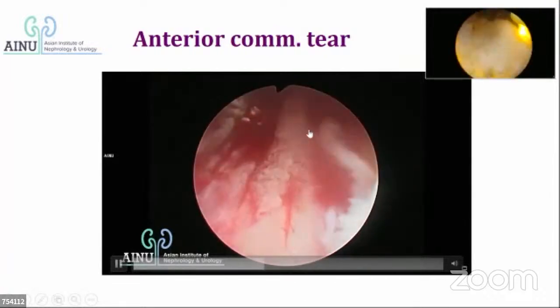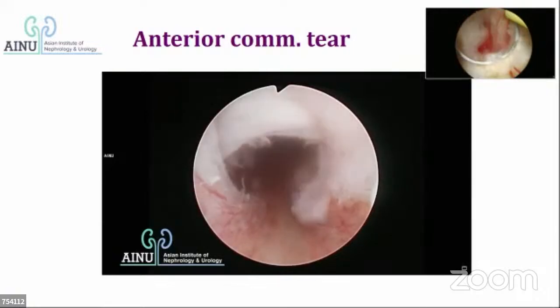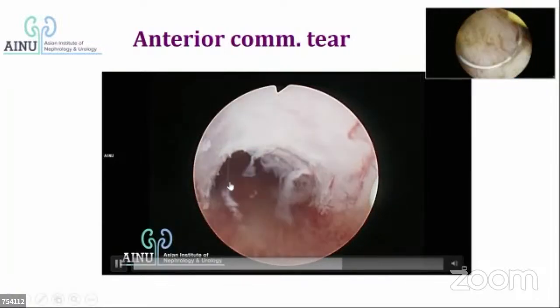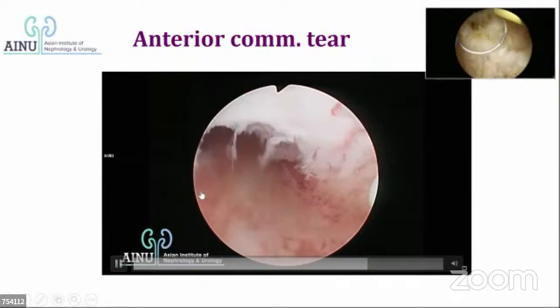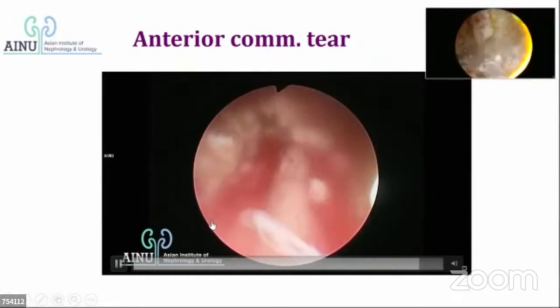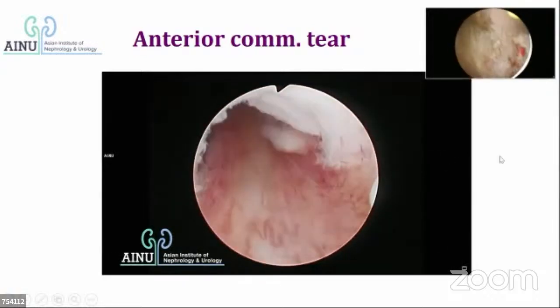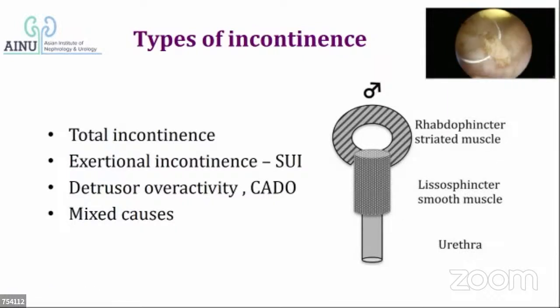Most of these things do produce a transient incontinence, but they do heal and produce continence. This patient might have incontinence because the resection has happened much beyond the veru, right up to the pelvic diaphragmatic area. So when you have this sort of an injury, incontinence may be quite certain, or if it doesn't, stress incontinence is significantly there.